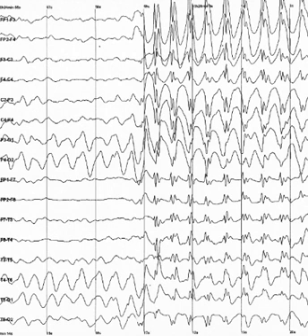Scalp EEG activity shows oscillations at a variety of frequencies. Several of these oscillations have characteristic frequency ranges, spatial distributions, and are associated with different states of brain functioning, e.g., waking and the various sleep stages. These oscillations represent synchronized activity over a network of neurons. The neuronal networks underlying some of these oscillations are understood, e.g., the thalamocortical resonance underlying sleep spindles, while many others are not, e.g., the system that generates the posterior basic rhythm. Research that measures both EEG and neuron spiking finds the relationship between the two is complex, with a combination of EEG power in the gamma band and phase in the delta band relating most strongly to neuron spike activity.